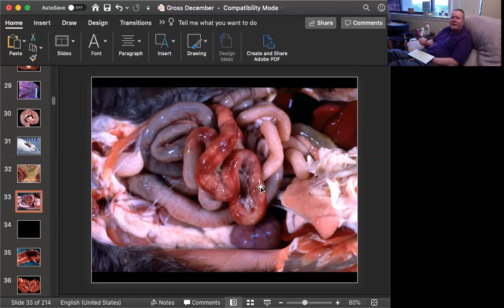And if you ever have to run the gut on a big animal like a cow or a horse, and you really quickly want to look for the affected area, you can feel the rough ones, or the parts that have fibrin on them, and that's the one that you really want to take a close look at. So the morphologic diagnosis is a segmental necrohemorrhagic enteritis.